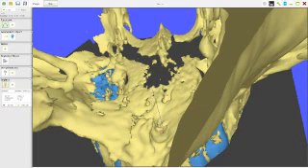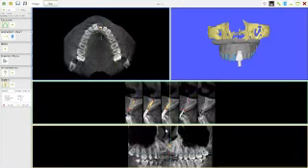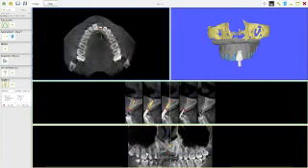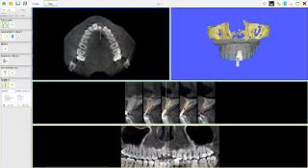Yes. And I could slide it out of the nose a bit. Dip it out of the nose. Then zero it round again. Go on to this section. And this is what it's beginning to look like now. So I think we've pretty well optimally placed that in all its best positions.